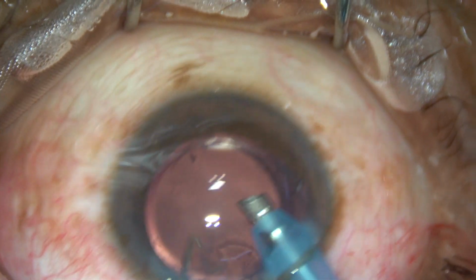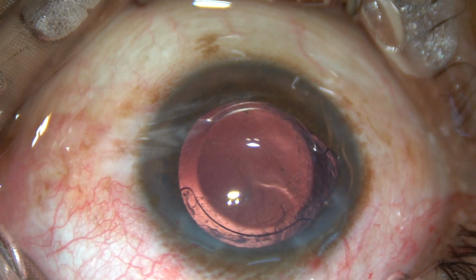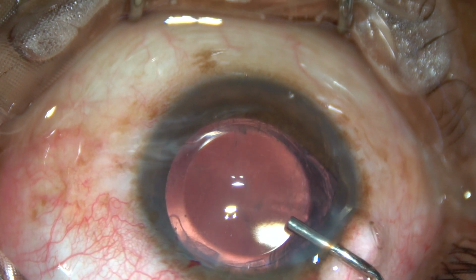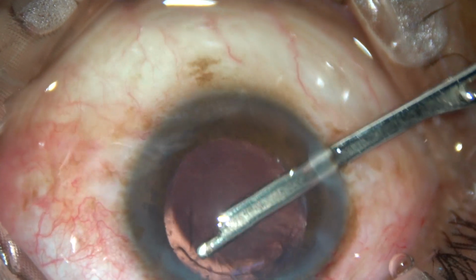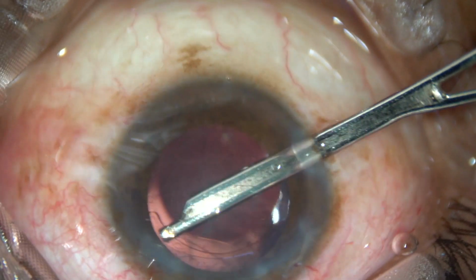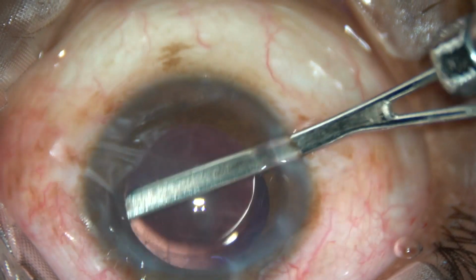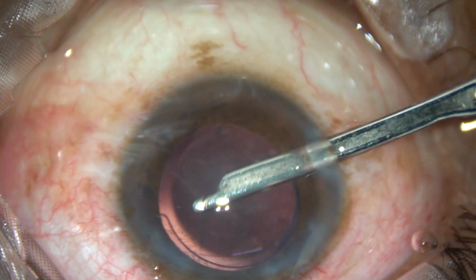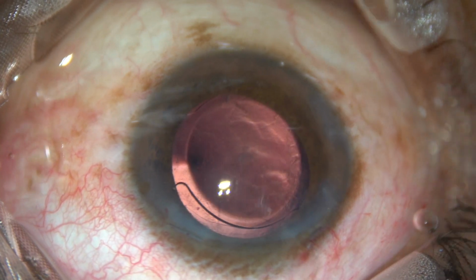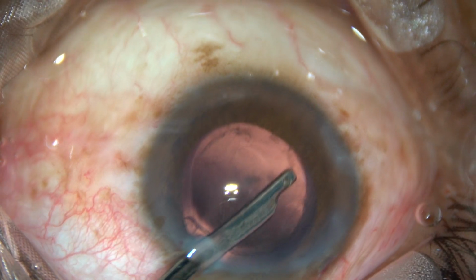And it was done very efficiently, very nicely, and there is no vitreous in the anterior chamber over the intraocular lens. So I am using the Simcoe cannula to remove the cortical matter, and here I could see that there is some vitreous strands coming into the anterior chamber through the rent at 5 o'clock.